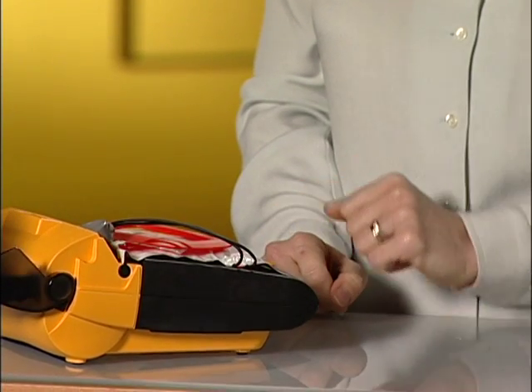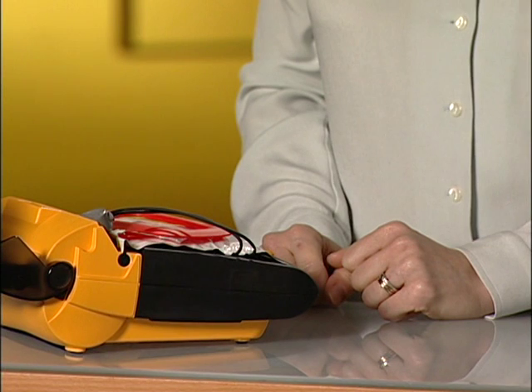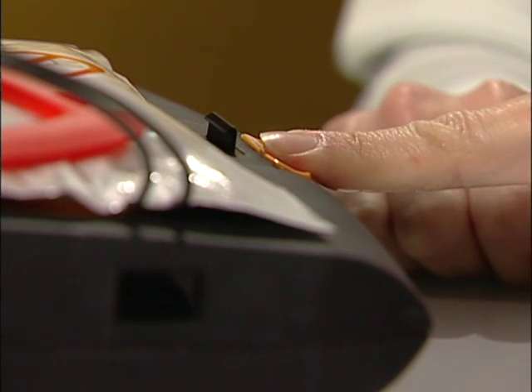Now we'll make sure the speaker is working. Push the lid release button to open and start the AED. You should hear the voice prompts. Call for help now. Now turn the device off. Hold this button for a few seconds until you hear it shut off. Close the lid, and that's the inspection.